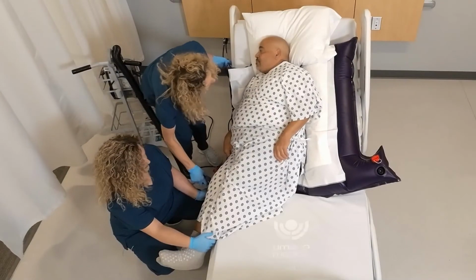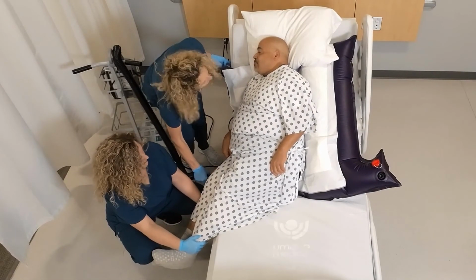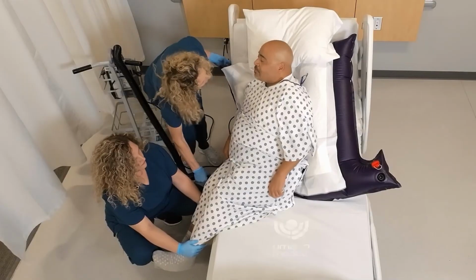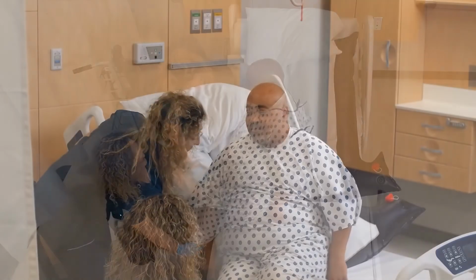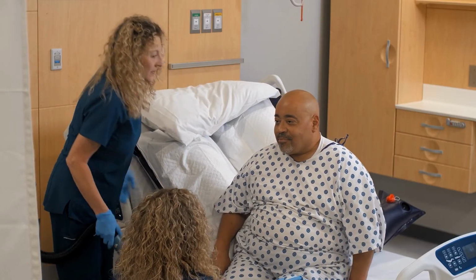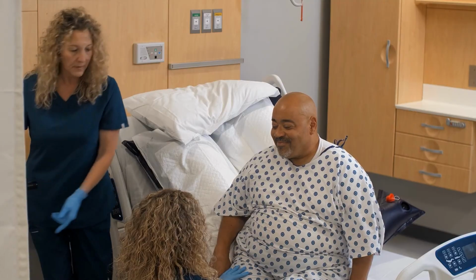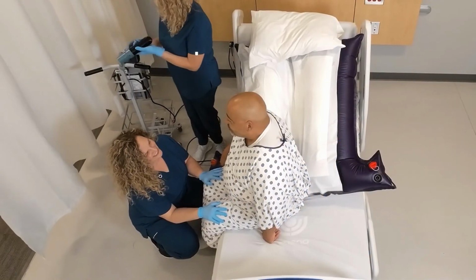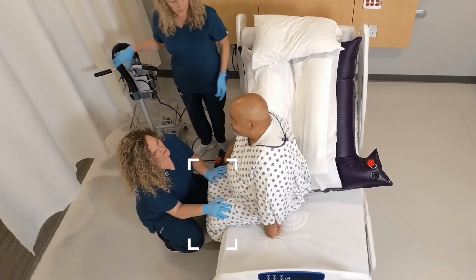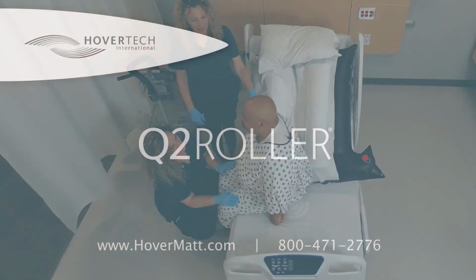One caregiver will be inflating the deflated chamber and monitoring the patient while the other caregiver will be guiding the legs to dangle at the side of the bed. As the deflated chamber is slowly inflated, the patient will begin to slowly sit further upwards. As the patient sits up, the caregiver assists the patient to move their legs to the side of the bed. That caregiver will also support the patient's knees while sitting on the side of the bed so they do not slide. The patient's back will be supported by inflating Q2Roller chambers.